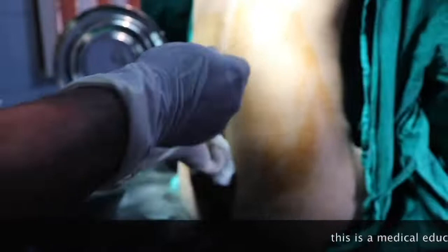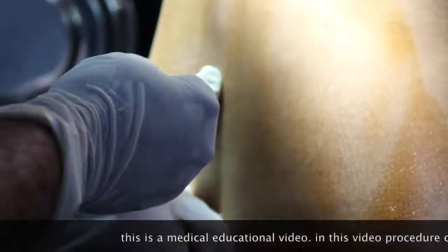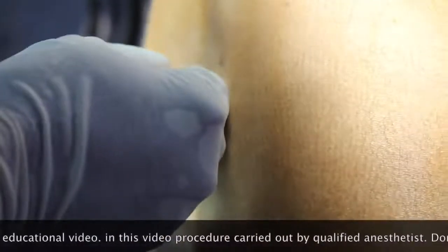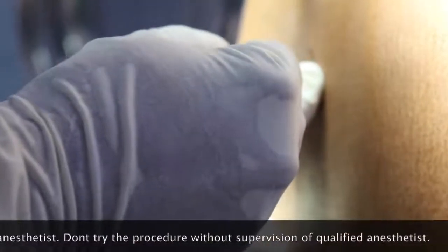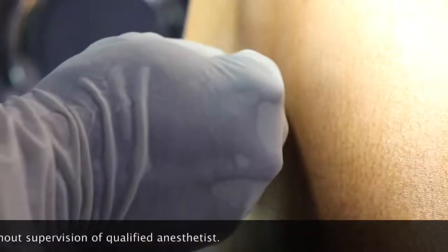This is a patient who is undergoing spinal anesthesia in the sitting position. After painting the site, the 26-gauge spinal needle is used to administer spinal anesthesia using the midline approach at Tuffier's point.